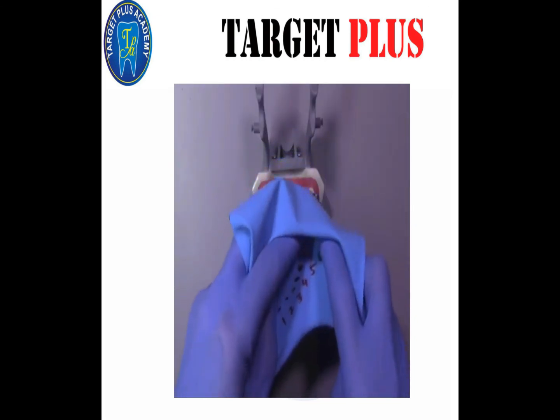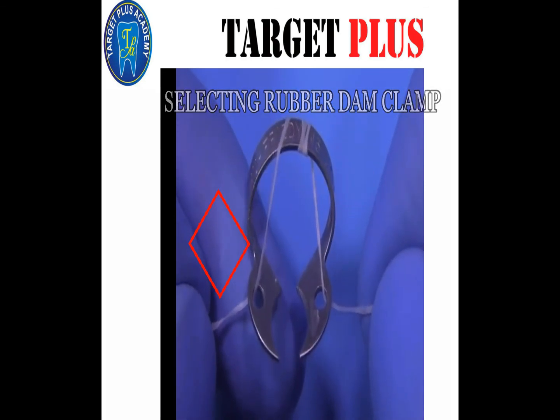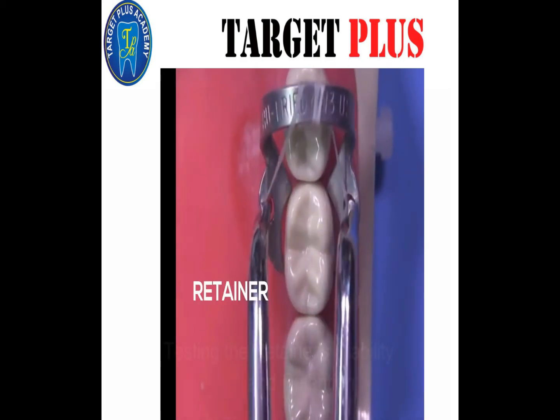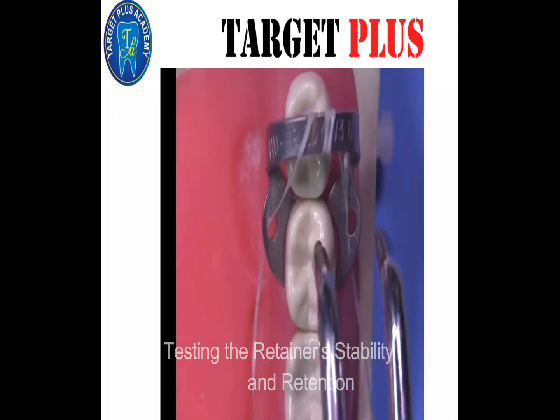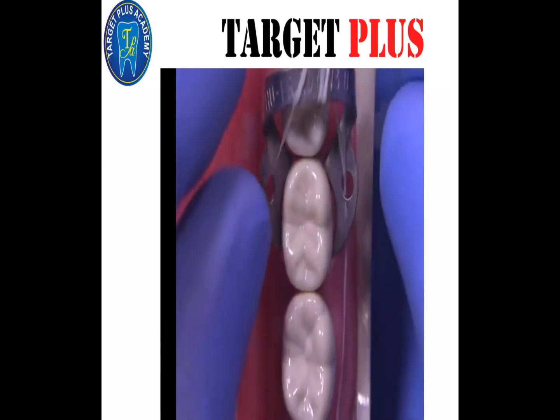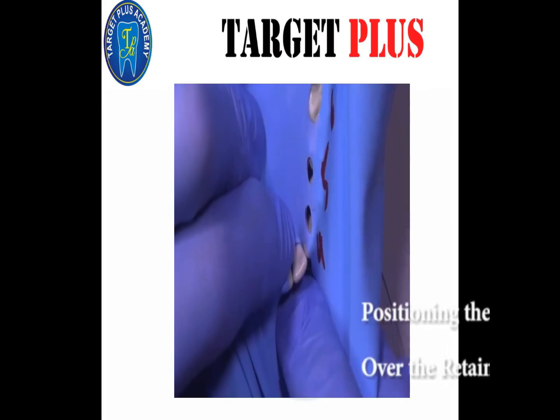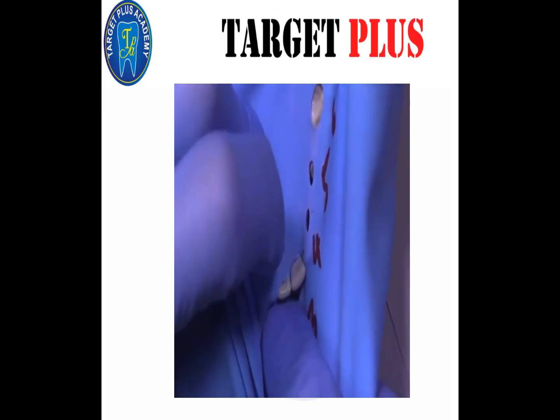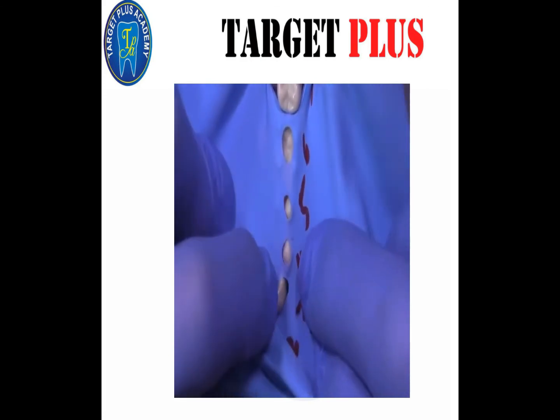Select the appropriate retainer and test the retainer stability and retention. There should be 4-point contact, as discussed before. Position the dam over the retainer. Before applying the rubber dam, a floss may be threaded over the anchor hole, so before applying the dam, a floss may be tied to the clamp.